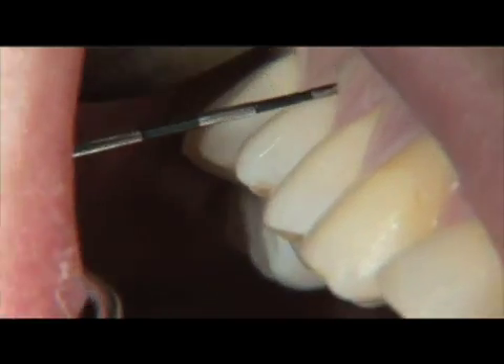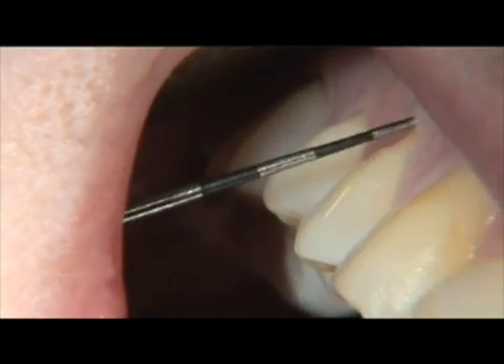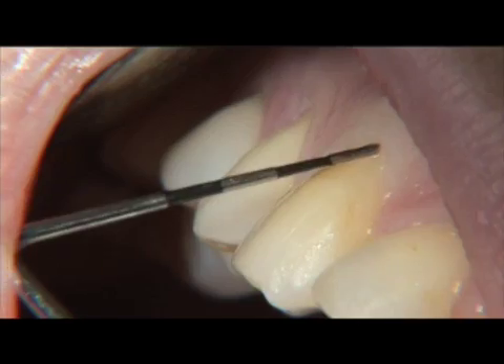One of the benefits of laser sulcular debridement and curettage is that it improves phase 1 periodontal therapy when used as an adjunct to scaling and root planing.